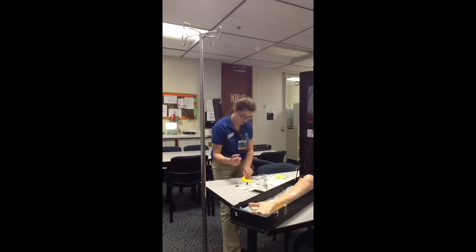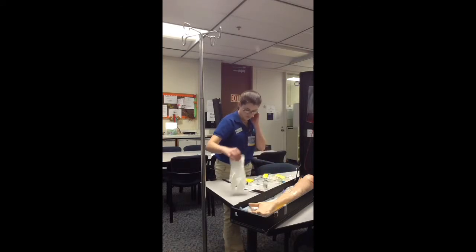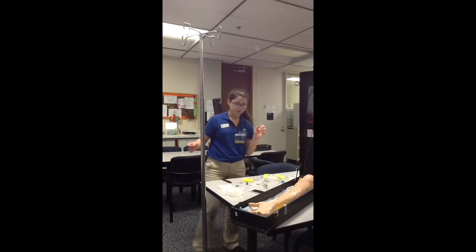I'm also going to label the tubing with my initials, the time, and the date. Okay, so now I'm ready to go into my patient's room.